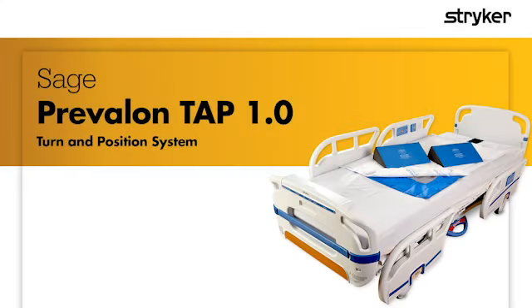The Prevalon Turn and Position System is designed to assist and maintain proper patient positioning to offload the sacrum. This can help prevent sacral pressure ulcers.